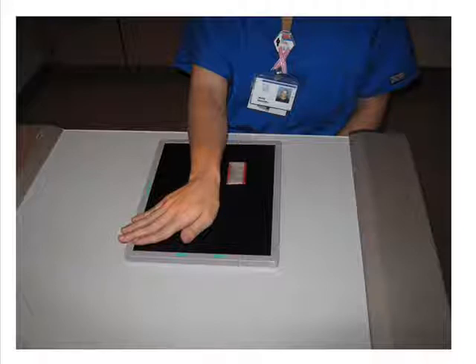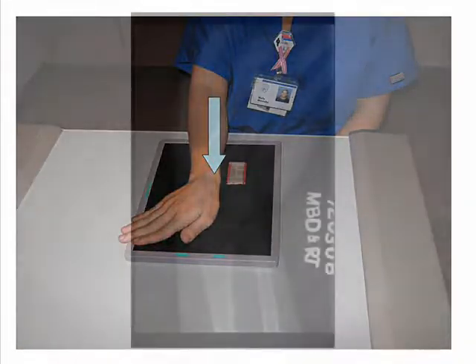The wrist is put in extreme ulnar deviation. The central ray is directed either perpendicular to the scaphoid or, for clear delineation, a CR angulation of 10 to 15 degrees proximally may be used. Collimation improves radiographic contrast. When making the exposure, the patient should remain very still, but suspended respiration is unnecessary.